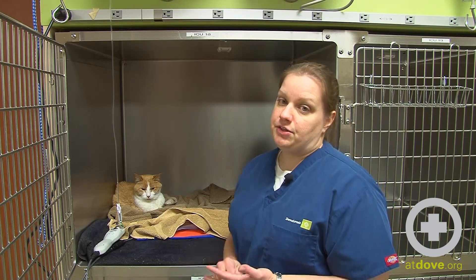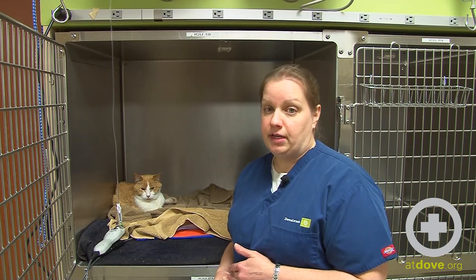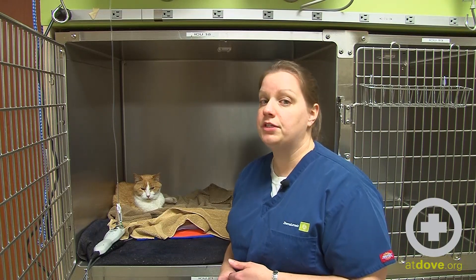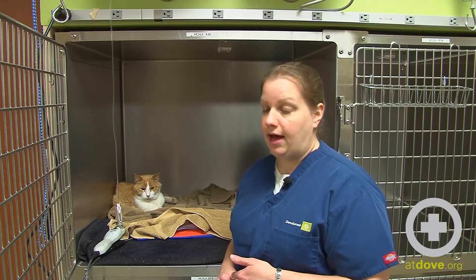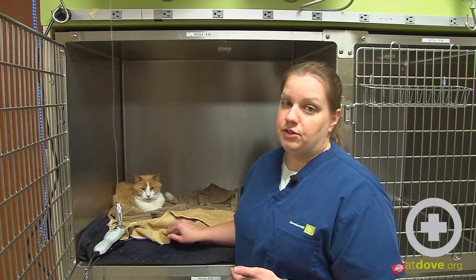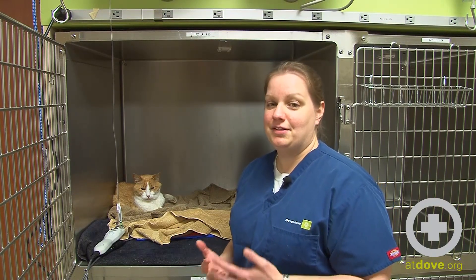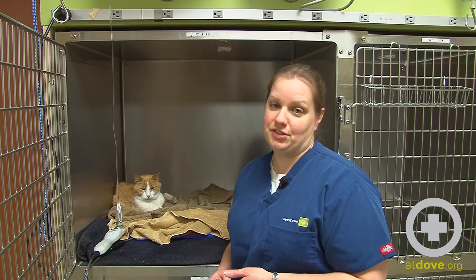These types of warming devices are great for patients recovering from anesthesia, and for cats like this who are going to be chronically cold because of a disease process. It is a safe way to warm the patients and keeps them happy and comfortable, and that is how we rewarm patients here at Dove-Lewis.